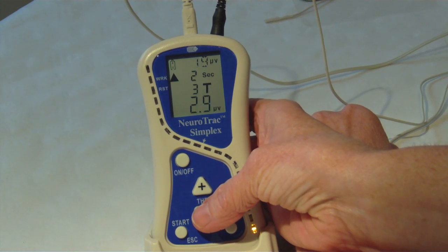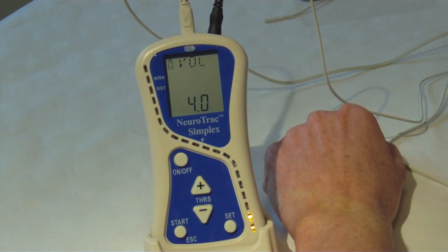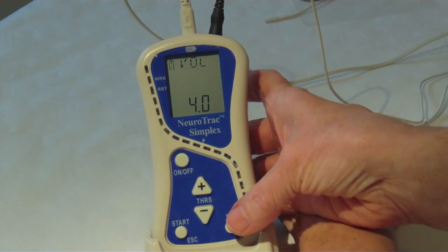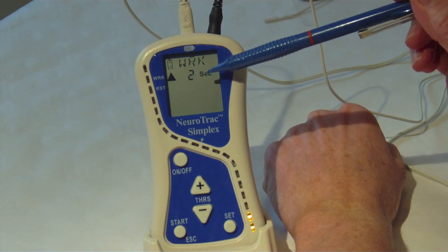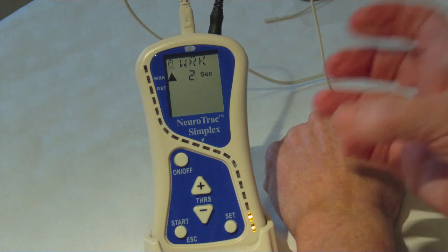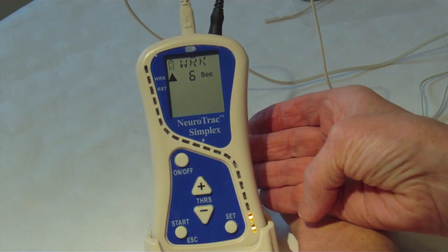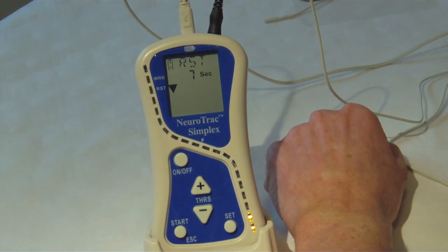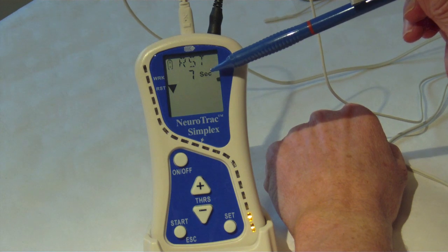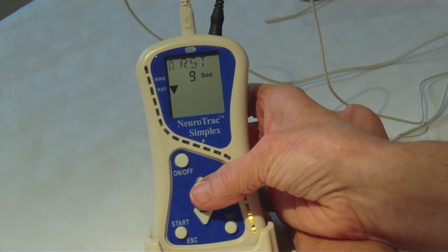The volume is next — press plus or minus to make this louder or quieter, then set. Work is how long you're going to hold on to the muscle contraction for; let's aim for a six second hold, so press the plus or minus button and then set. Rest is how long the muscle will relax between contractions — I'm going to have a 12 second rest time. Press set.